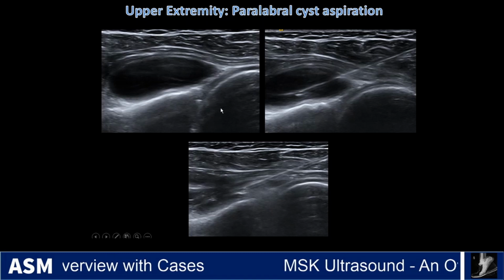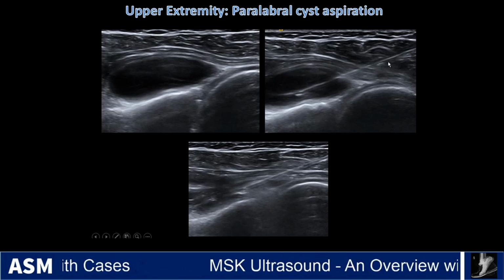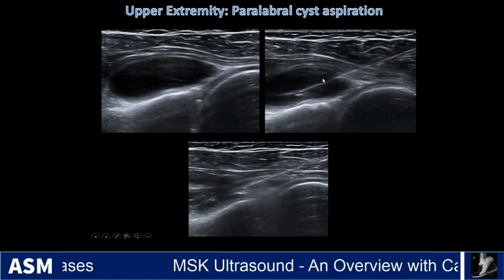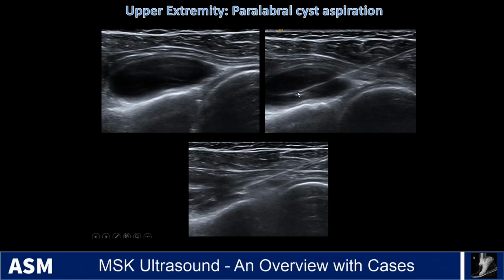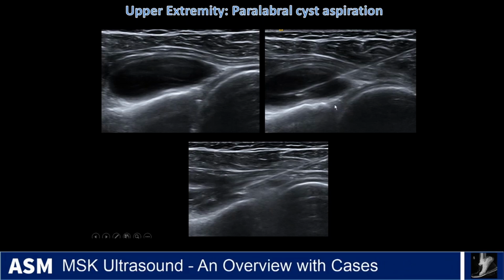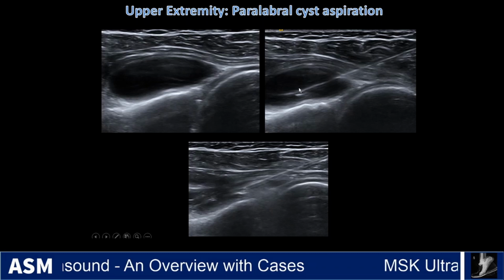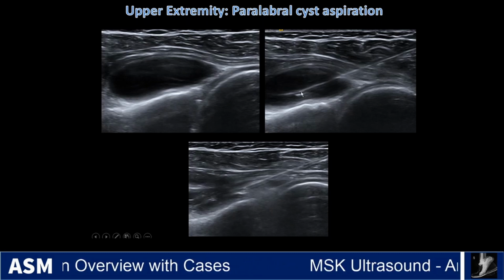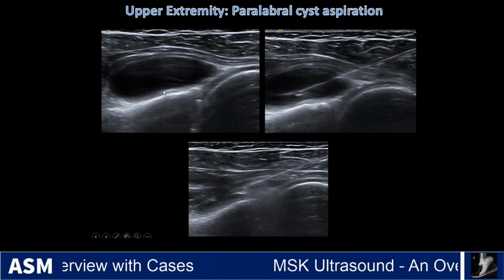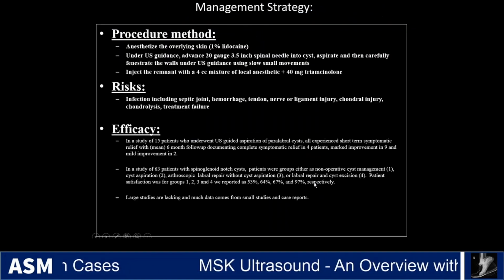And in this case, the patient was symptomatic from it. It was impinging on one of the nerves, and so the request was to drain this cyst. Now, this is potentially not going to cure the situation because you still have the labral tear and you still have potential for a one-way valve allowing fluid to accumulate in this, but can provide potential relief at least temporarily, and in some cases it may be longer lasting. So this is before, during, and after when we've decompressed the cyst here.